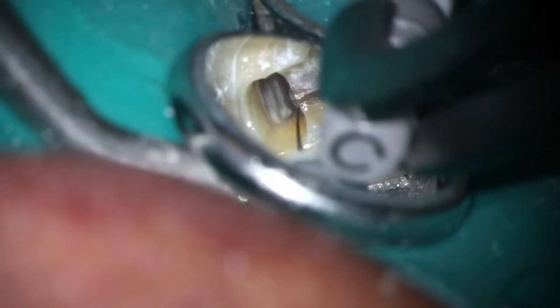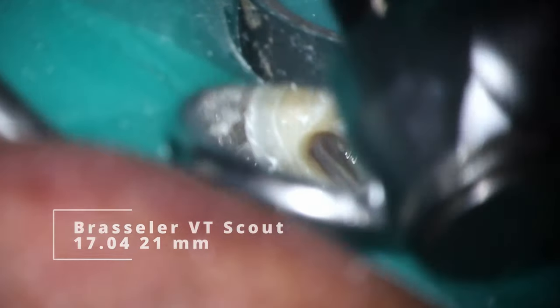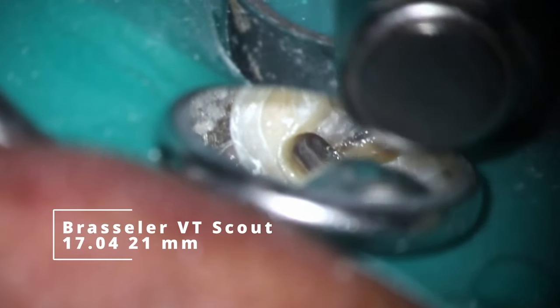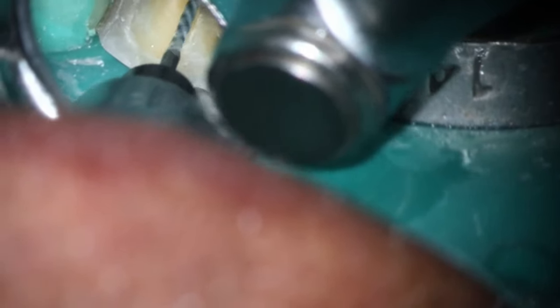I know it seems like I'm too far to the mesial, but you'll see once we've got everything cleaned out that on the final x-ray, that's actually where you want to be. Still within the dentin, close to the enamel area — I know it looks like the access is a little too far to the mesial, but once you open it up it lines up really nicely. Opening this up here with a 17. There's a little calcification on this one so I want to make it a little easier to get my working length.